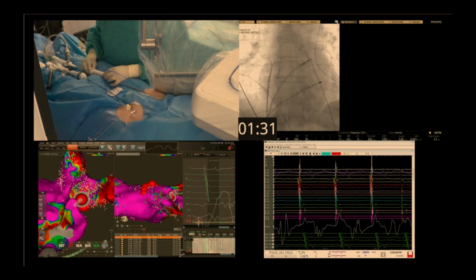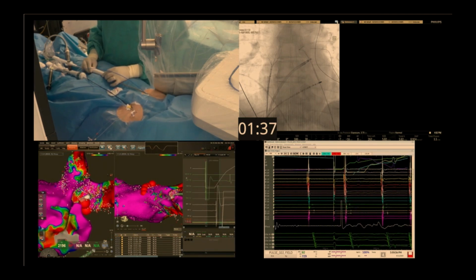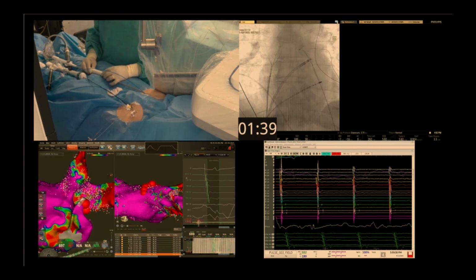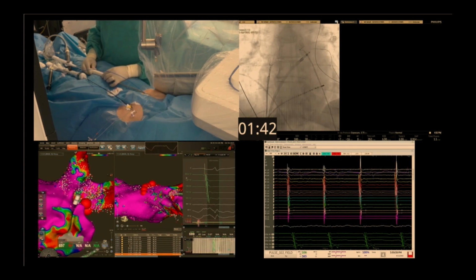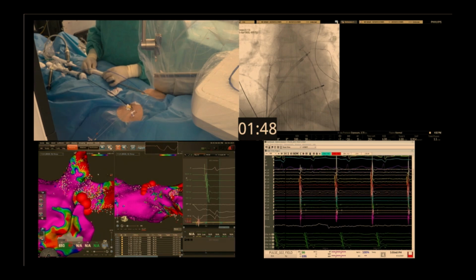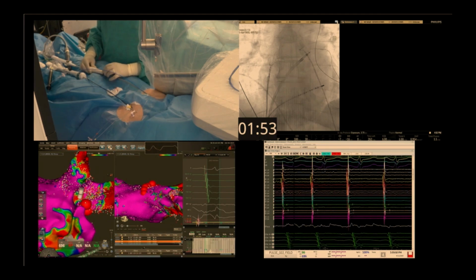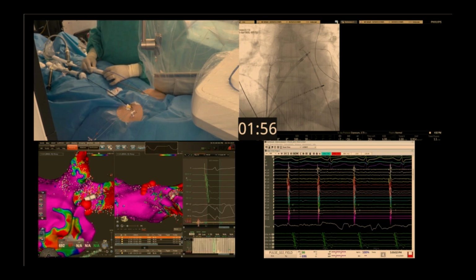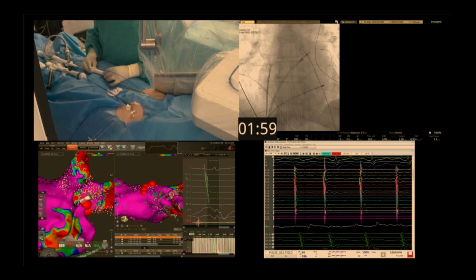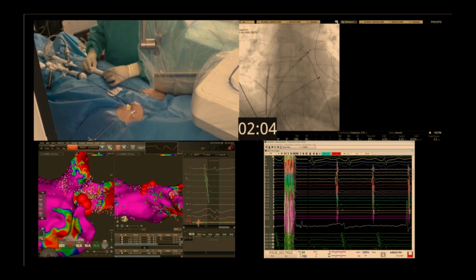And what's really exciting about this instantaneous ablation is that you can imagine a situation, which we don't have yet, where the catheter is integrated with the mapping system. It actually has a magnetic sensor, it's just not communicating. Then the operator is moving the catheter, and as they get close to the location, the system senses contact and just delivers on the QRS. Then you go to the next. It's like how we used to do drag lesions. So automatic. Again, we don't have that going yet, but that's the next step. You can certainly imagine it.